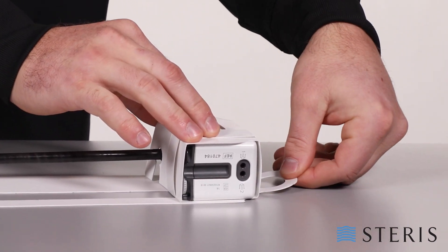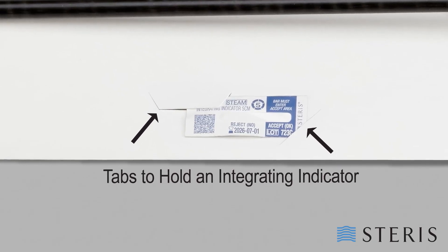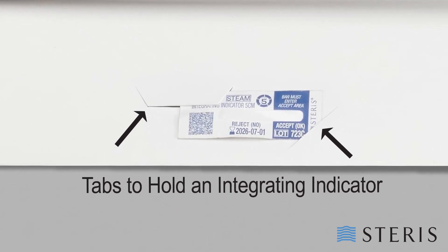The last step to assemble the robotic arm instrument card is to fold down the finger ring on the back of the proximal end. Steris also offers other products to complete packaging prior to sterilization. The robotic arm instrument card features two tabs that can hold a verify steam integrating indicator.